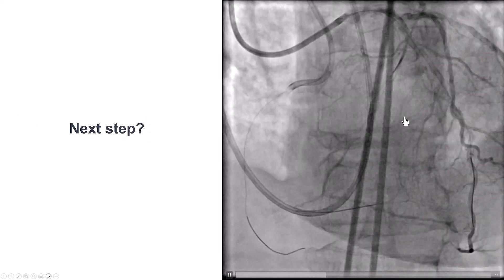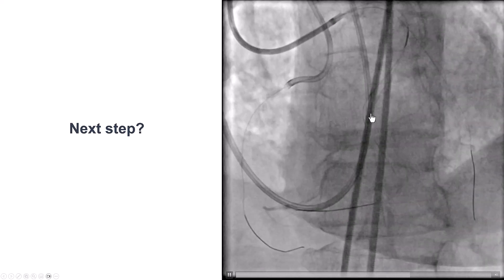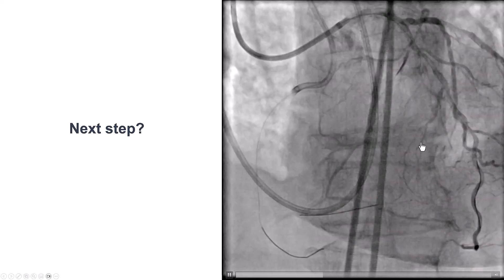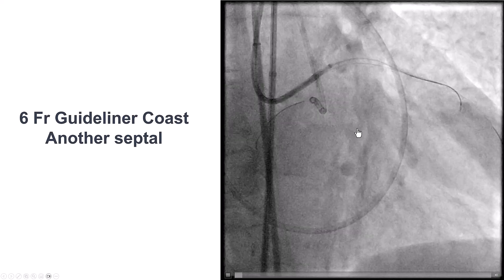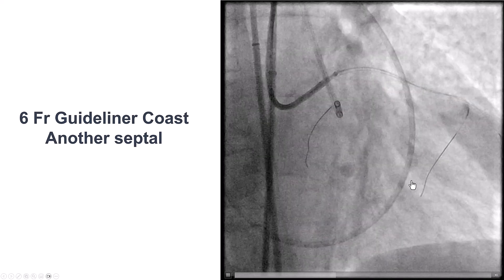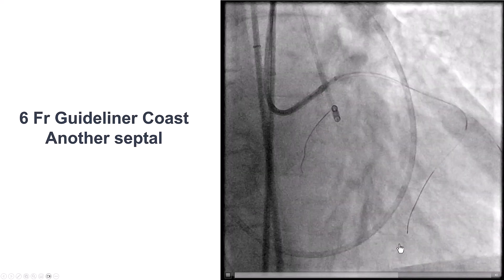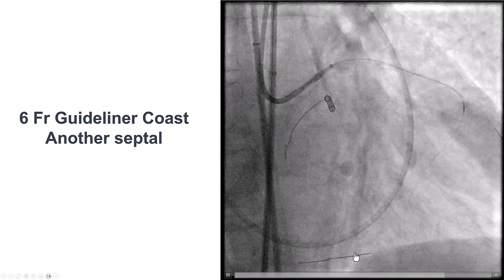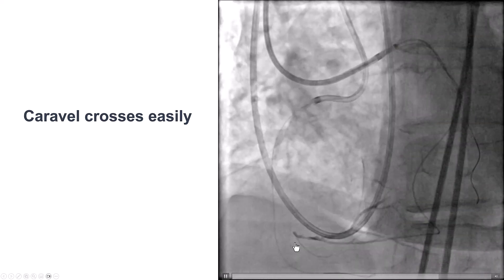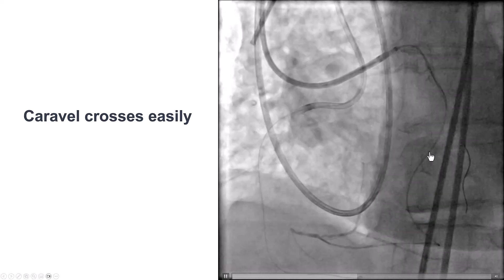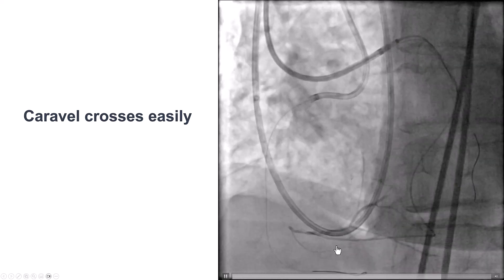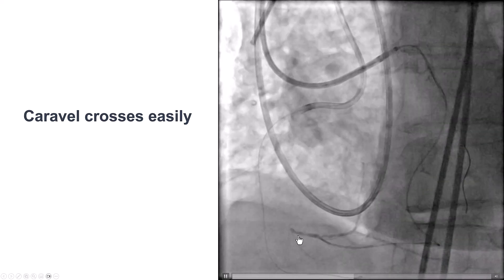One option would have been to take a small 1.0 to 1.5 mm balloon and perform dilation. But since there was another bigger septal further distal, we decided to go for that one and switched to crossing through the second septal. This is again a Sion black guide wire, and fairly easily the wire successfully crossed through that branch. We confirmed this was the true vessel. After delivering the Caravel — no problem this time — we are through this secondary PDA and injecting into the distal RCA, which is of small caliber.